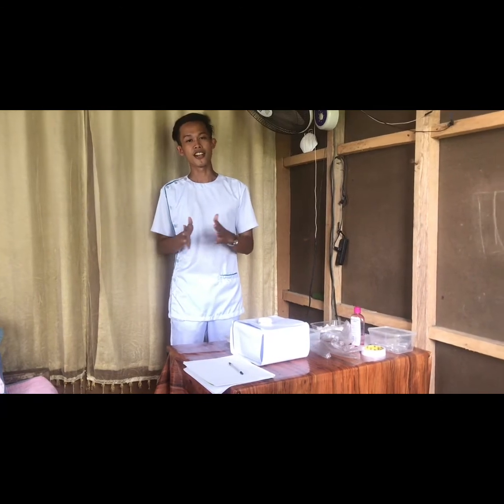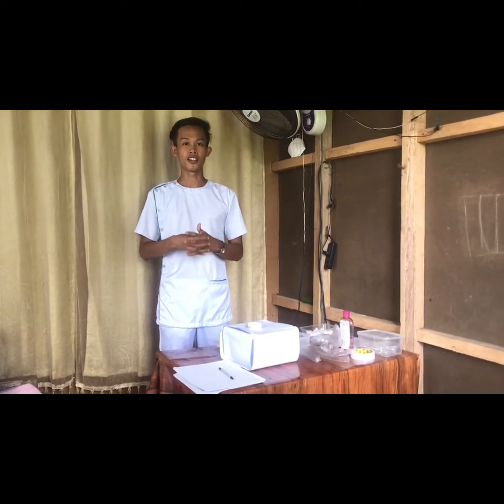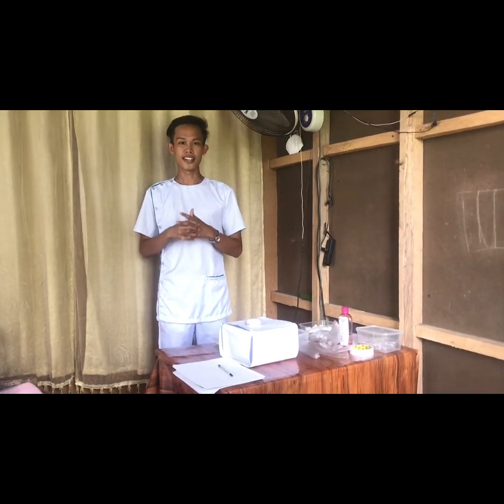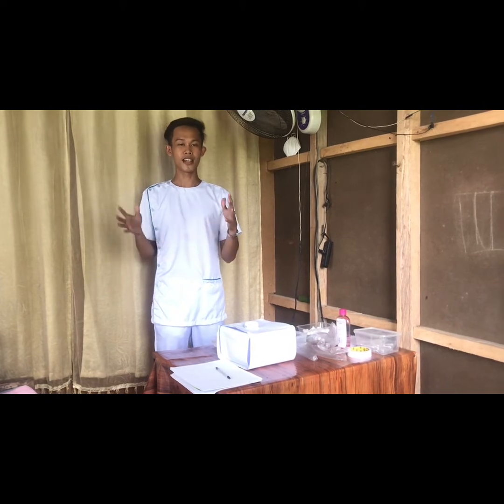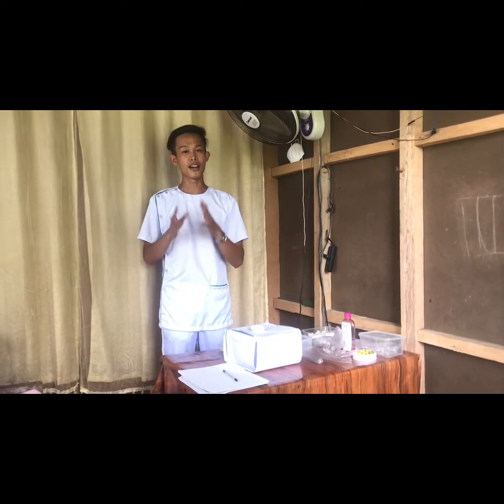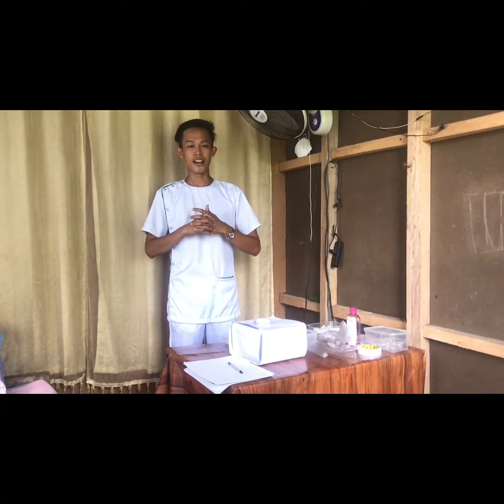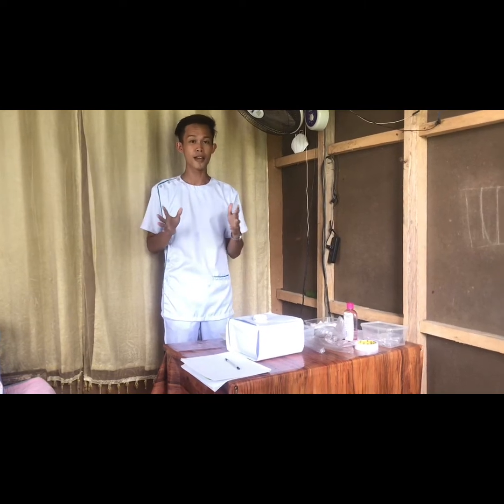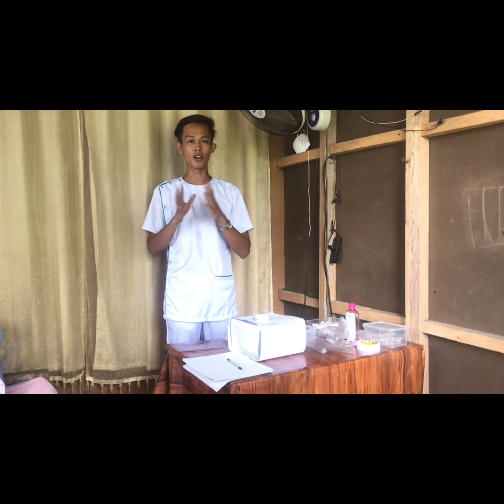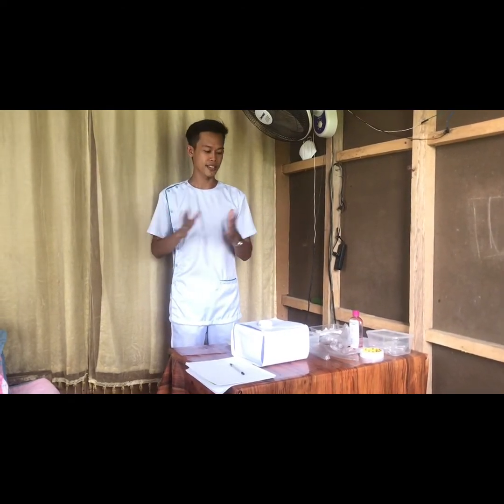Catheterization is defined as the introduction of the catheter through the urethra into the bladder for instilling or removing fluid. The purpose of catheterization is to control urinary incontinence and to relieve urinary retention. I am already done performing hand hygiene in order to eliminate microorganisms, and privacy for the patient is now secured.